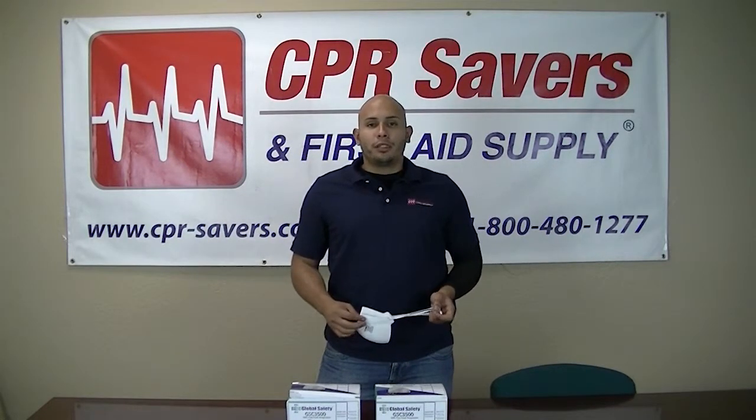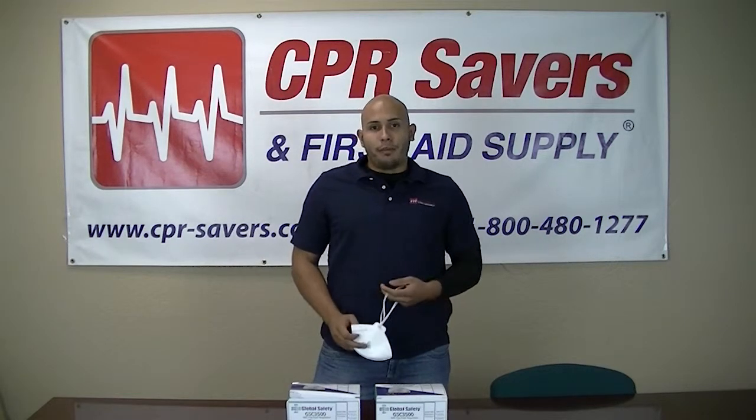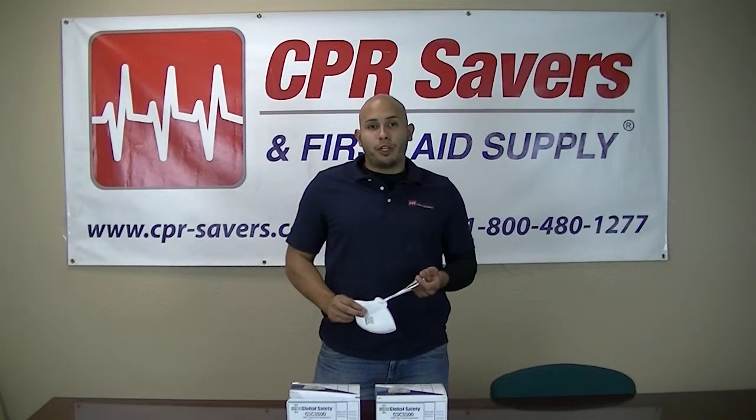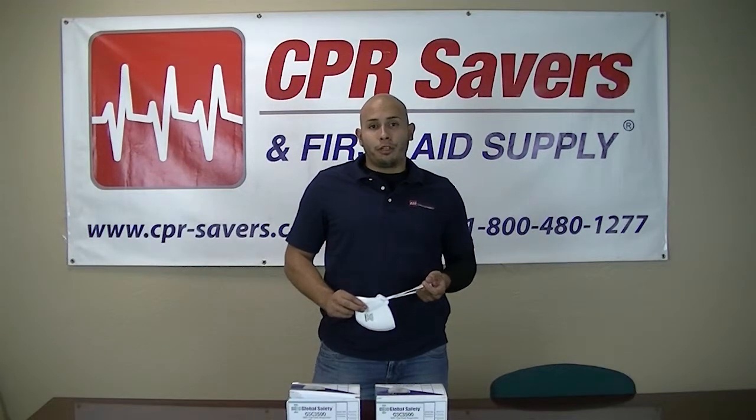Hi, my name is Andre with CPR Savers and First Aid Supply, and today we're going to be working with the Global Safety N95 respirator mask. This cup style respirator is a foldable respirator that fits into a pocket or purse. This mask is used to reduce exposure to airborne germs.